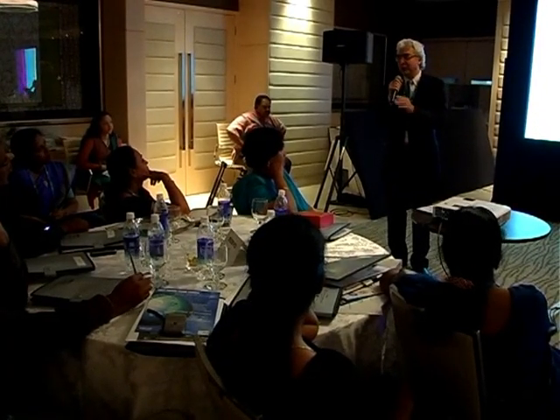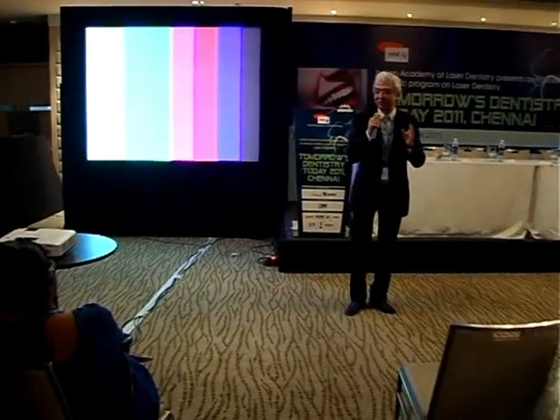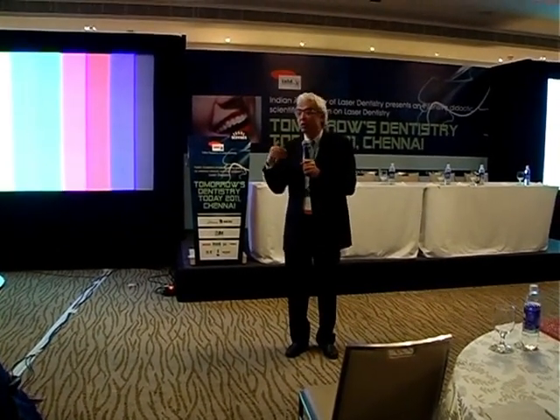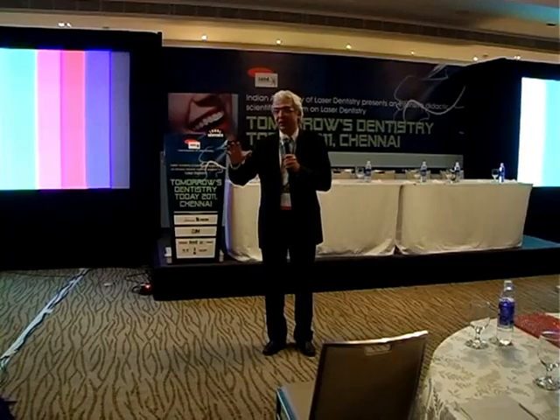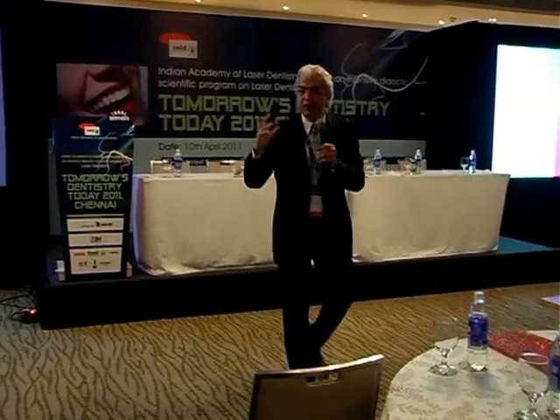If you look at the review of literature on this, I would say 25% of the papers say you don't need to etch. 75% of the papers say you definitely need to etch. And I think that it's safer for us to etch and then bond. Some of the papers also say that if you do laser etching, that reduces the bond strength, but that's about 5%. So I think the consensus here would be that you etch even after doing a laser etch like what we did right now.